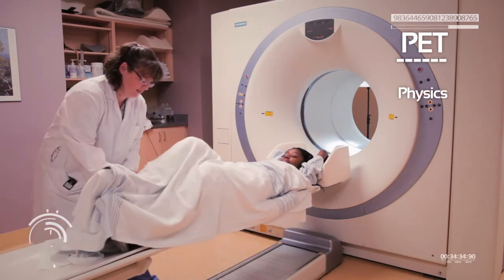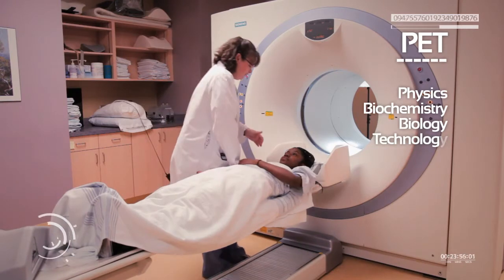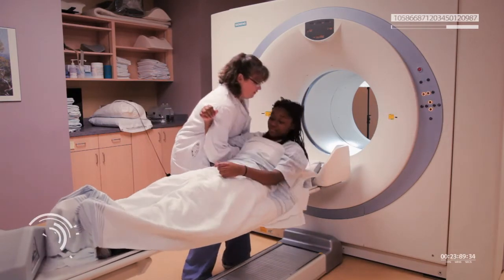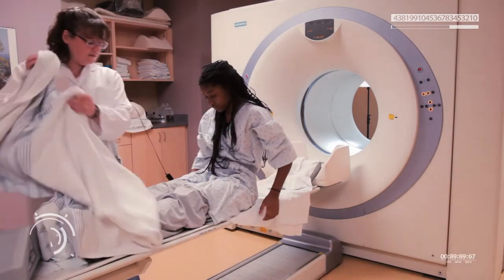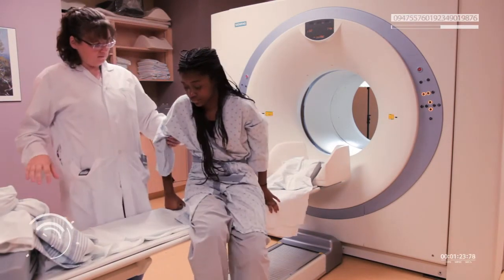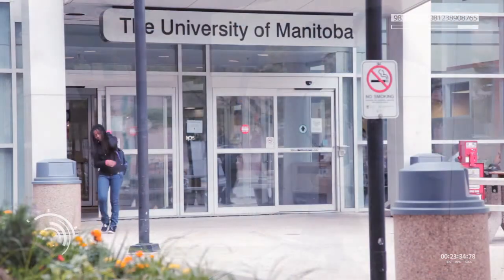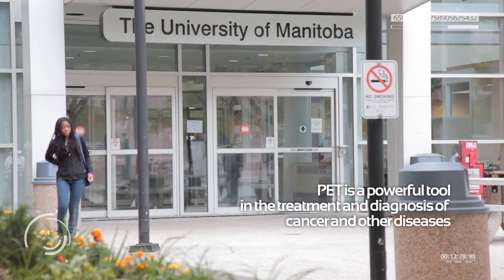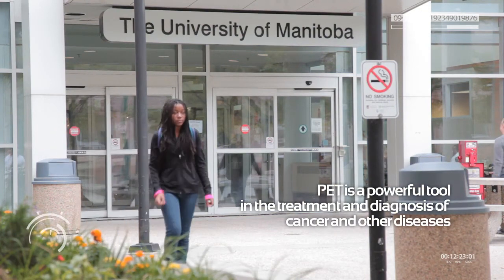PET scanning brings together physics, biochemistry, biology, and technology to create detailed images of cell and tissue function in the body. When disease affects tissues, their biochemistry changes, and radioactive molecules can then be used to track those changes. Especially when combined with CT scanning, PET is an incredibly powerful tool in the treatment and diagnosis of cancer and other diseases, helping us to visualize and identify abnormal or diseased tissue.